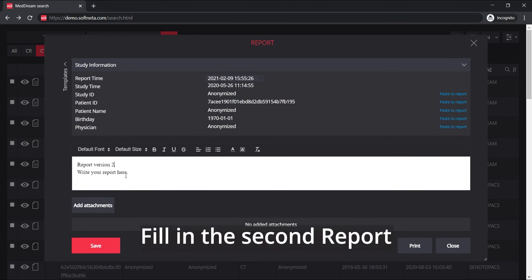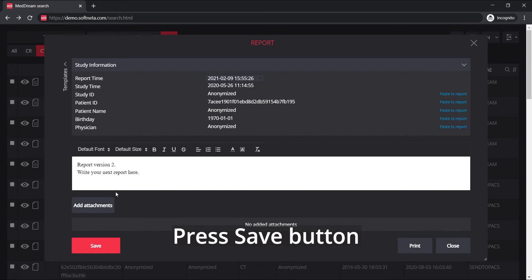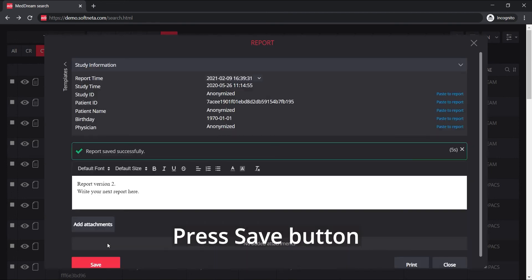Fill in the information for the second report, then press the save button in the close report window.